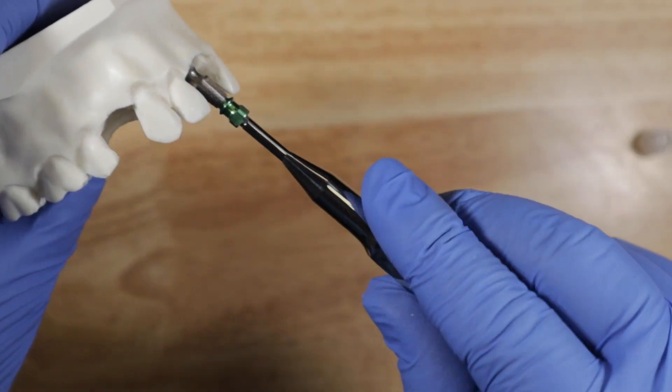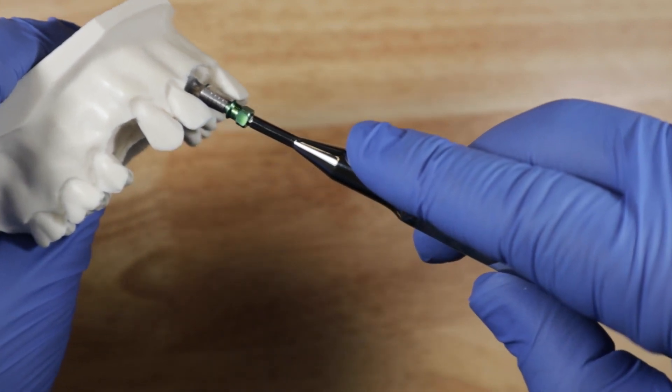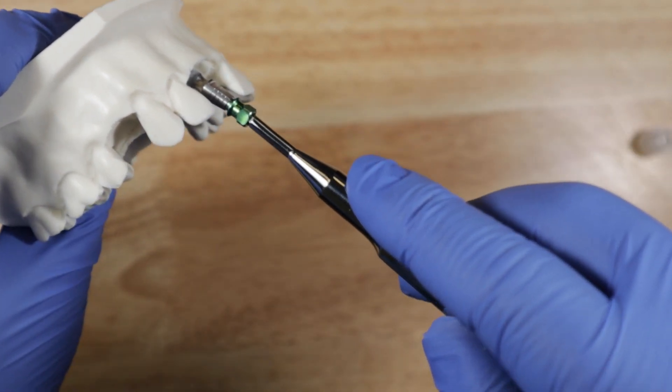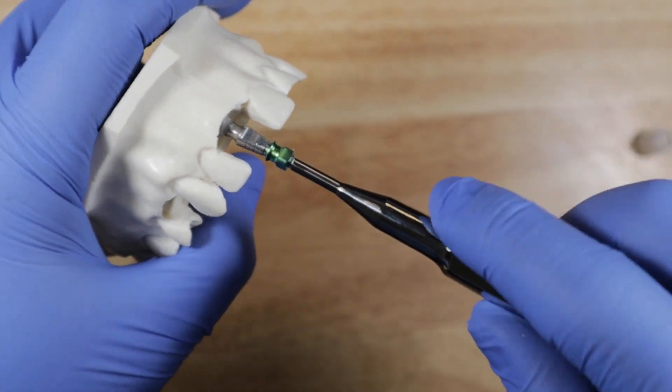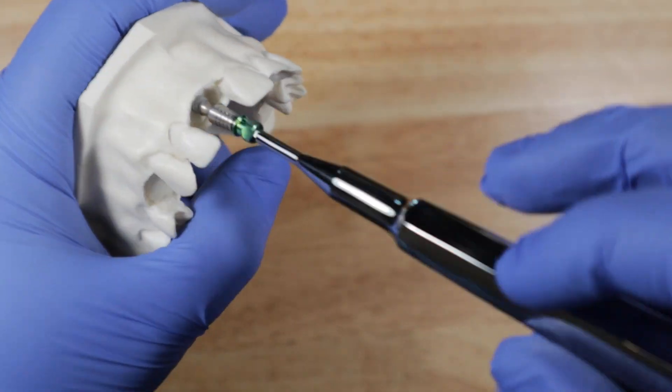So this way you can actually apply pressure buckly, lingually or side to side. So you can use it to apply the pressure as you turn the implant.